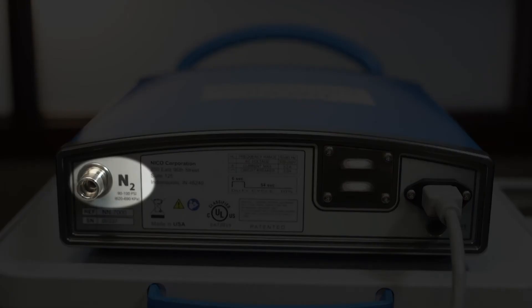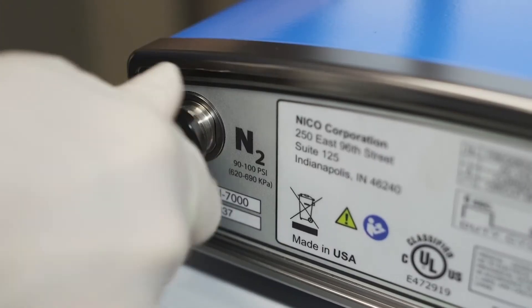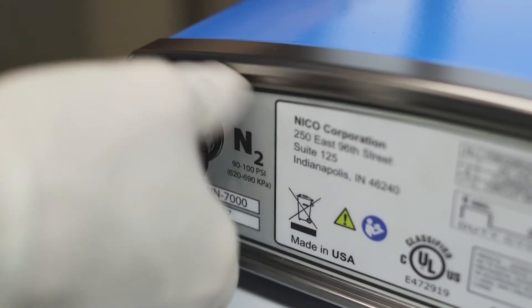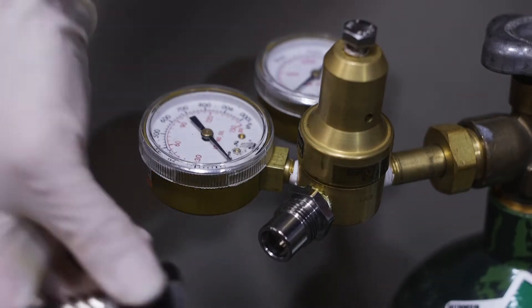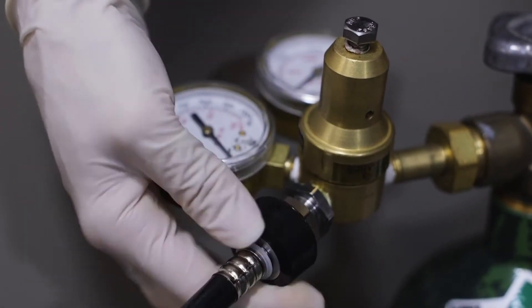Supplied with the console is an 18-foot nitrogen line. Insert one end of the nitrogen line into the male fitting on the rear panel of the console and tighten the connection firmly. The opposite end of the hose should be attached to your facility's nitrogen supply connection.